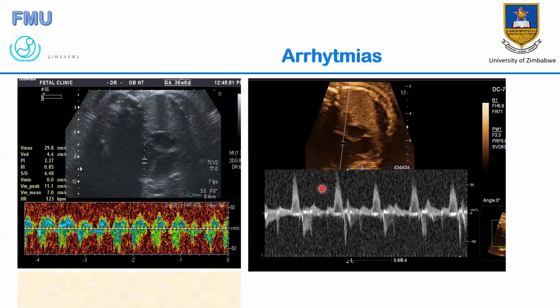It doesn't matter what rate the atrial is. If the ventricular rate is not in tune with the atrial, then the cardiac output will be reduced, because the ventricular outflow is the one that determines the cardiac output. So when you are doing the fetal heart rate, you want to do the ventricular rate instead of the atrial rate. So please get this right. Let's continue.